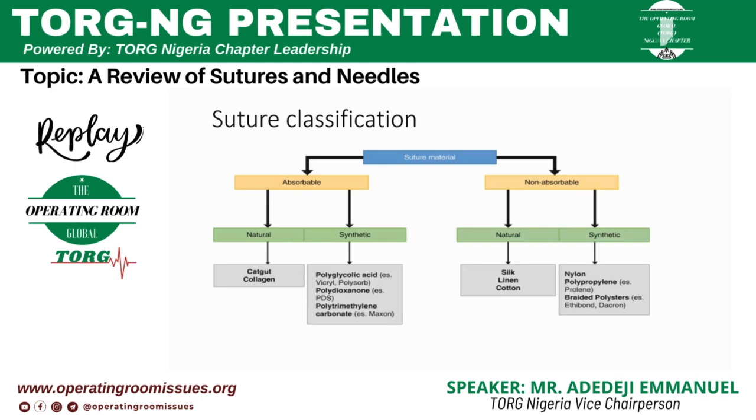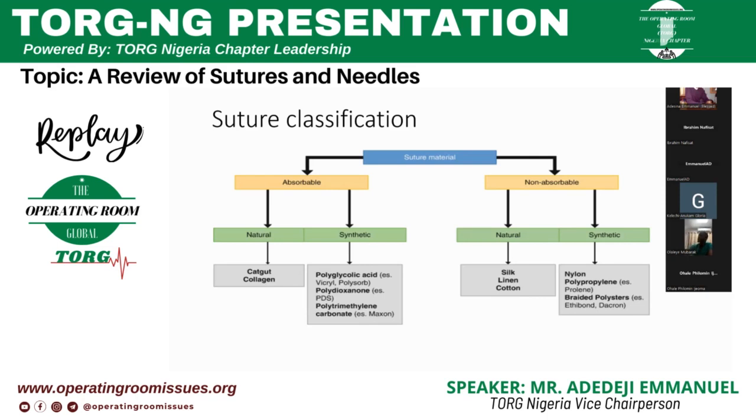Some centers in the developed world, and in some city medical centers, can afford to totally switch to the use of synthetic sutures.